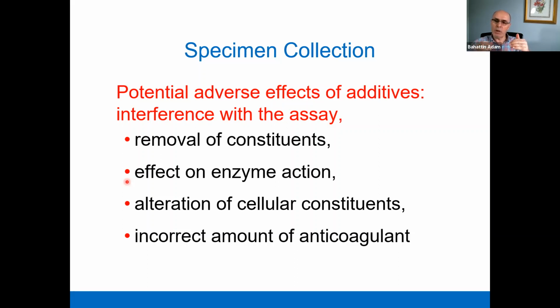If you withdraw a low amount of blood, you will change the ratio between anticoagulants and the total blood that you withdraw. Therefore the evacuated tubes should be filled enough in order to keep the ratio between the total blood and anticoagulants or additives.